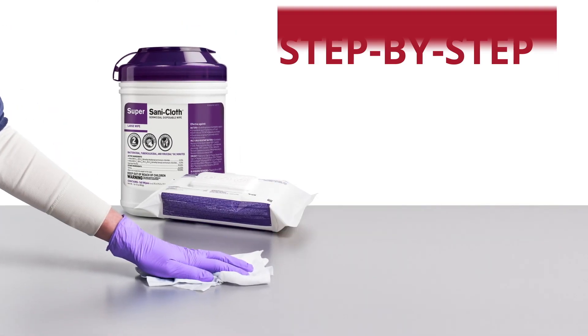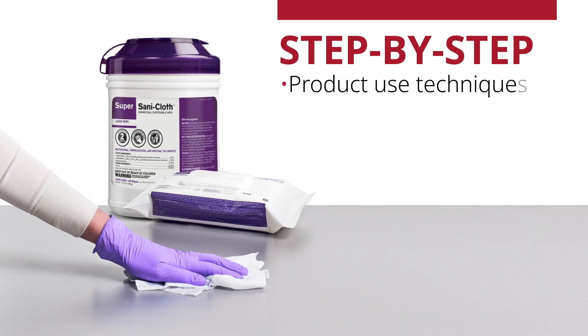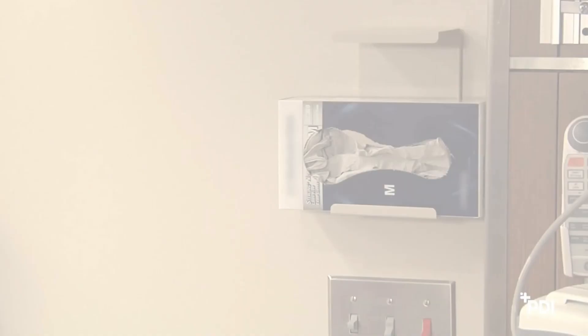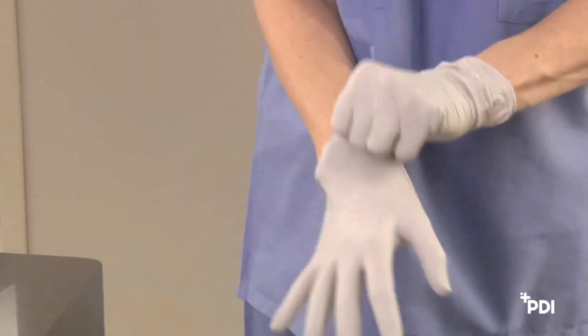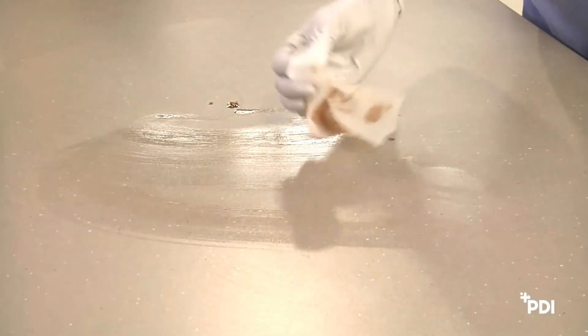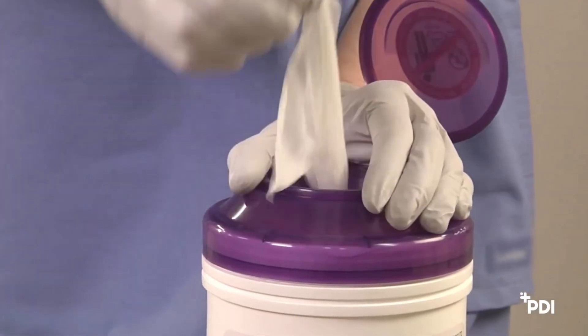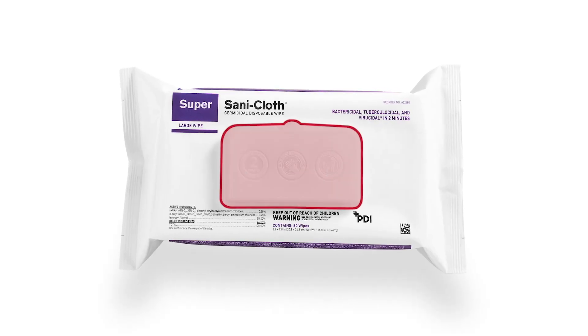The following section provides step-by-step instruction on product use techniques, procedures, and protocols necessary to ensure proper compliance. When using SuperSaniCloth Germicidal Disposable Wipes to clean and disinfect blood and bodily fluids, be sure to wear gloves and other personal protective equipment as appropriate. Always dispense wipes either through the canister lid or through the soft-pack lid.